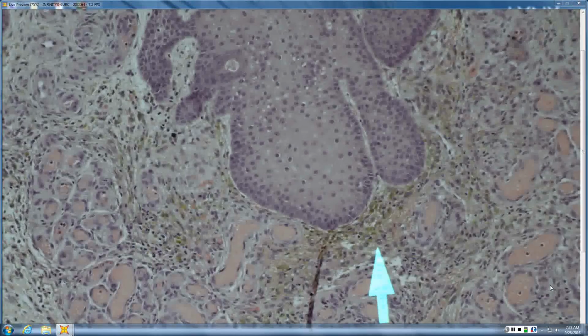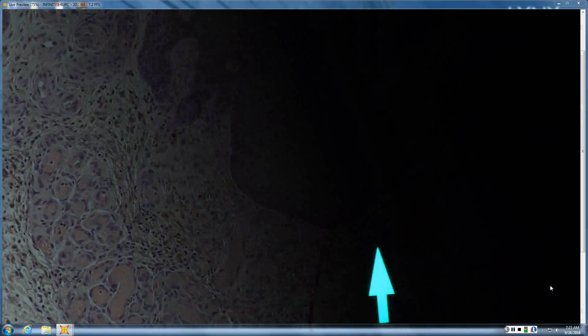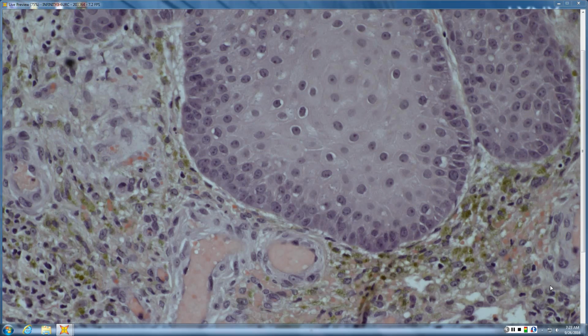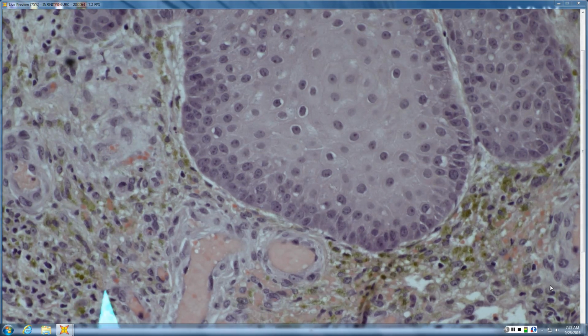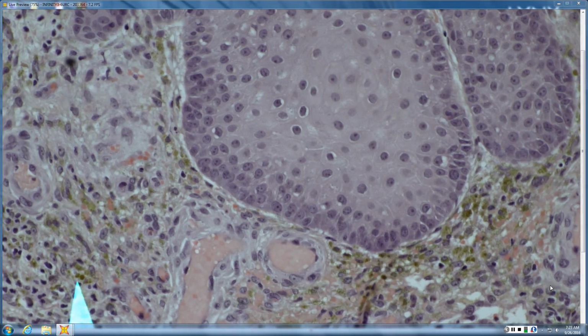Sometimes it can be difficult to distinguish between hemosiderin and melanin, but if you do the little fake polarizing thing, it is refractile, kind of like red blood cells, whereas melanin is absolutely not refractile. And then if you look really close, if it's more of a yellow-brownish appearance and you have huge granules, that is much more likely to be hemosiderin than melanin. And of course you can stain it with iron stains and all that sort of stuff and truly tell the difference if it's very difficult.